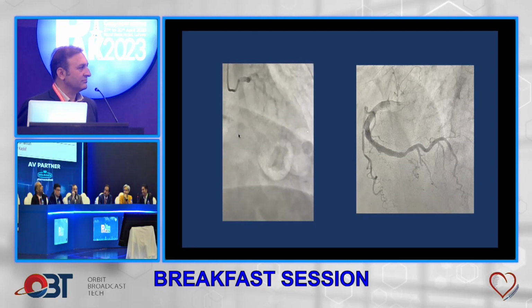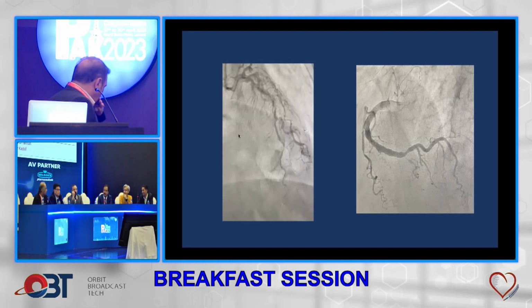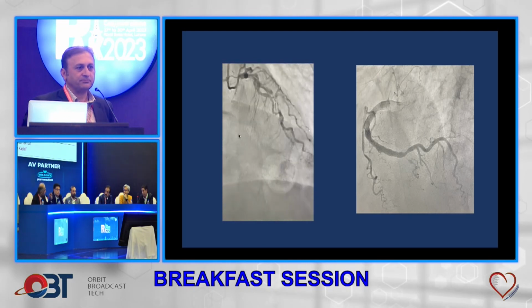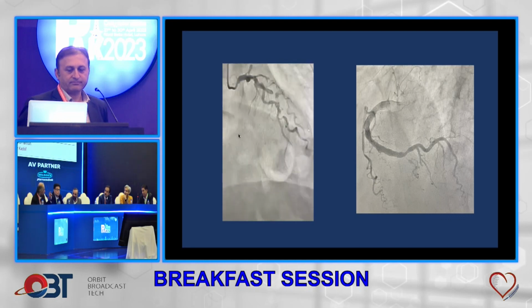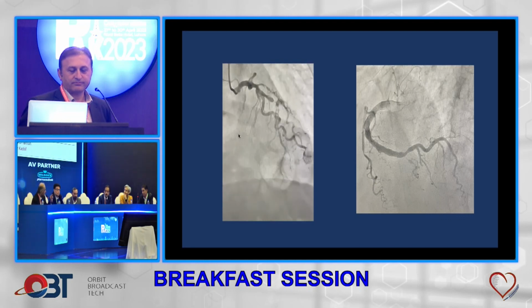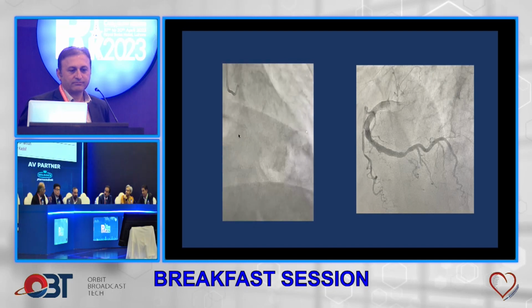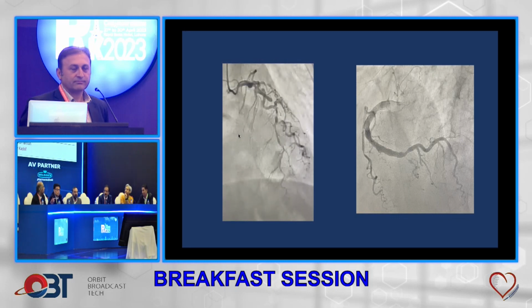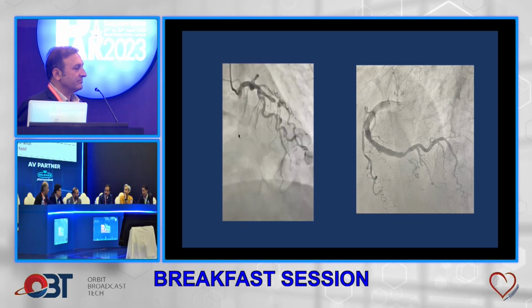No, basically, when you're doing this, it is the over-the-wire balloon, the same thing as the microcatheter. The difference is that the microcatheter may float in one direction, but an inflated balloon will usually tend to stick to one place. This trick, of course, only works when you are sure that the lesion is centrally placed. But sometimes it could be very difficult to say, first of all, whether it's centrally placed or not.